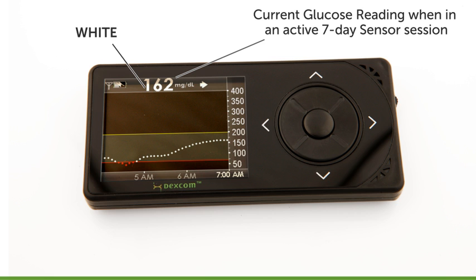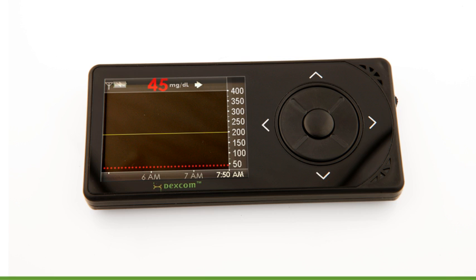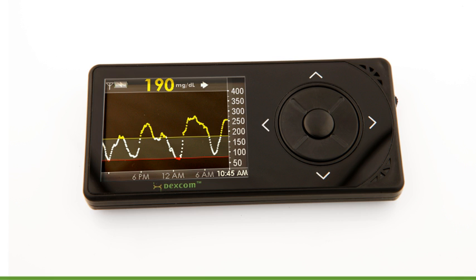This number will be white if it's in your target glucose range, red if it's low based on your settings, and yellow if it's high. The dots on your trend graph will also change color based on your low and high alert settings. Note, if your low glucose alert is not set and your glucose level is 55 milligrams per deciliter or lower, your glucose value will be red. You can view your past glucose information through the 1, 3, 6, 12, and 24-hour trend graphs. Access these trend graphs by pressing the up or down buttons.